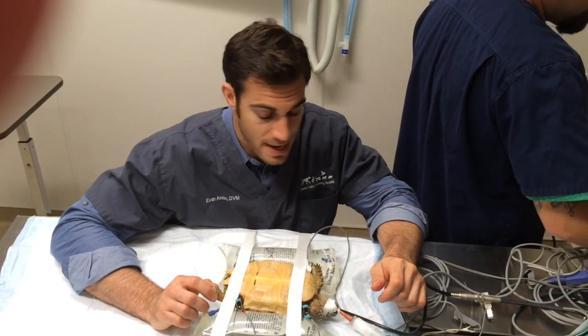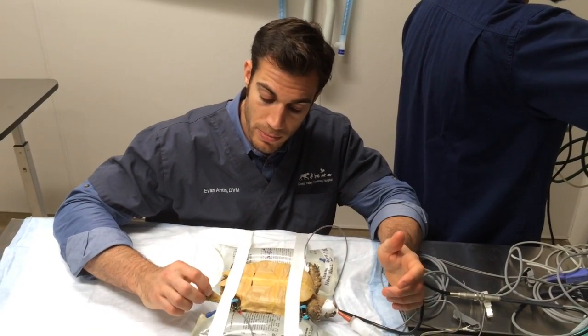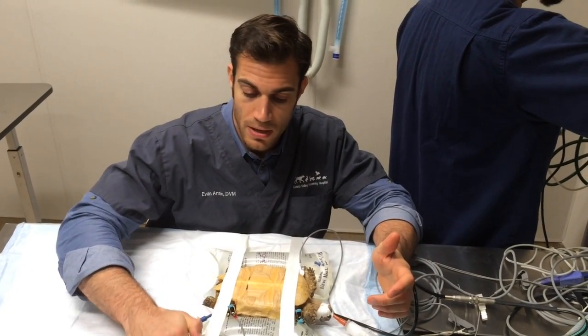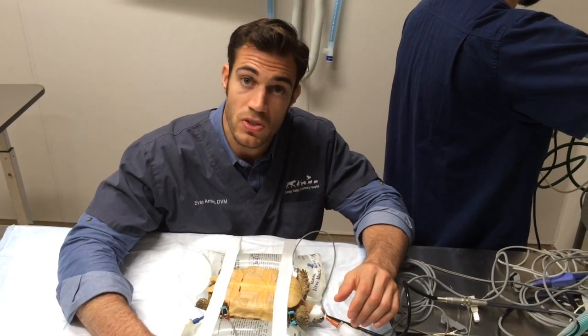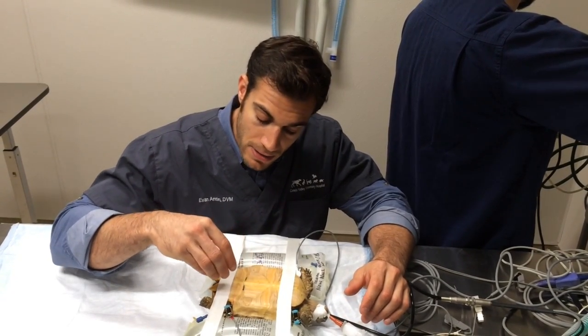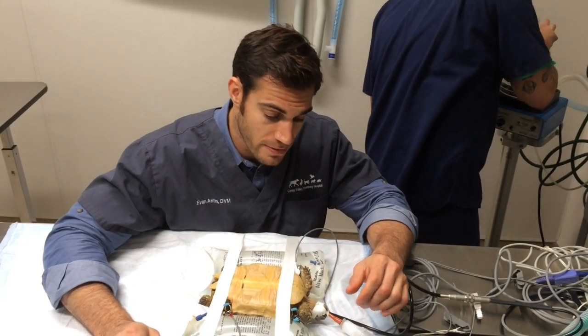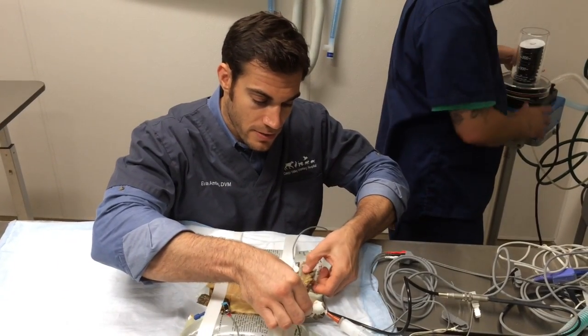This poor sulcata actually has bladder stones. Sometimes these guys live with stones for a period of time and it's not a big deal. But these ones are so big that they're occluding and are really taking up most of the bladder. Not only that, they're causing a bad secondary infection. She has a urinary tract infection on top of it. So just a young African spurted tortoise.